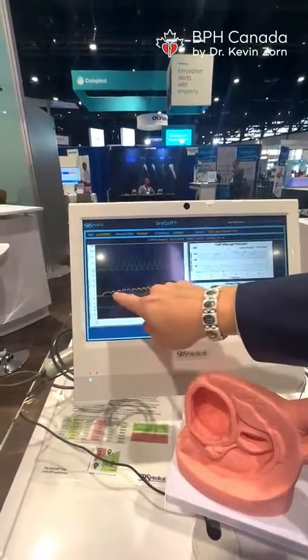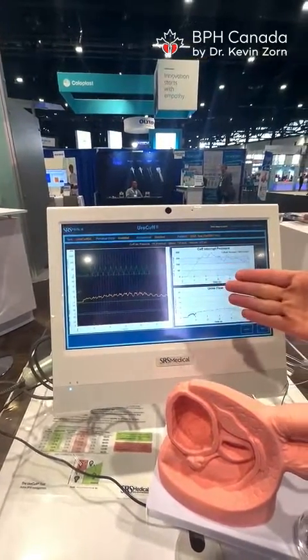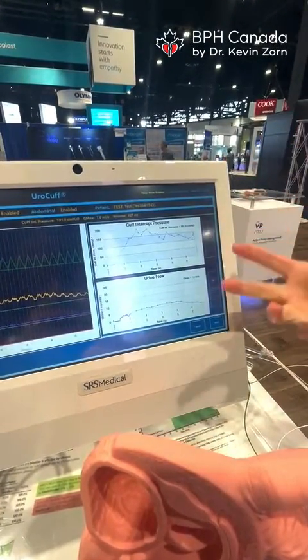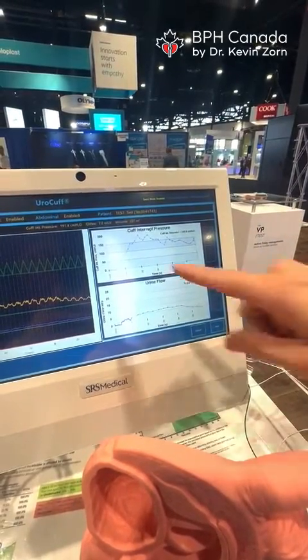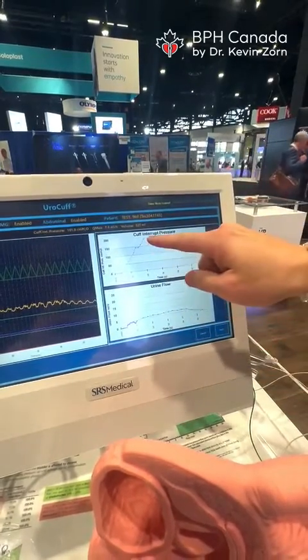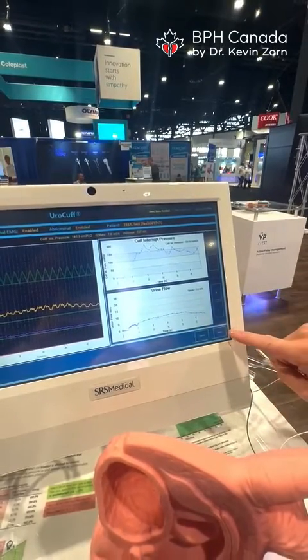All right, so after having urinated, you can see on the left there are multiple pressure readings. That's the uroflow, the standard report that we would get with a uroflow. But what are we getting different in the UroCuff? Well, during the pressure readings, we're able to generate what kind of detrusor contractility is going on. Normally, the bladder can provide a certain amount of centimeters of water, but if it's having to work extra hard to generate a flow, in this case high pressure, low urinary flow, that's not good for the bladder.